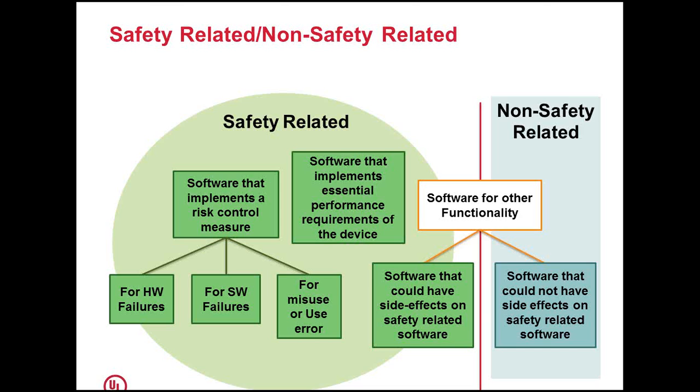What could be non-safety related? Non-safety related could be software that doesn't have any side effects on safety related software. So once you have identified safety related and non-safety related, it will be easier to deploy the controls appropriately.